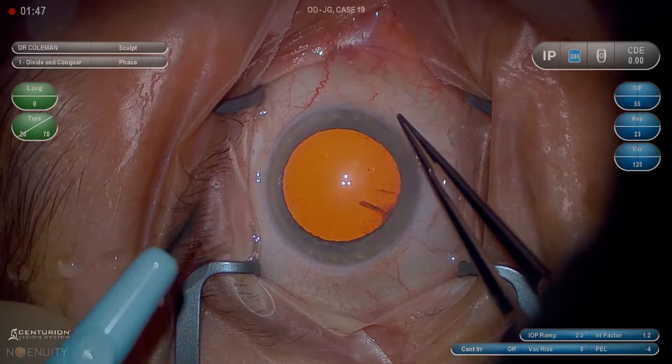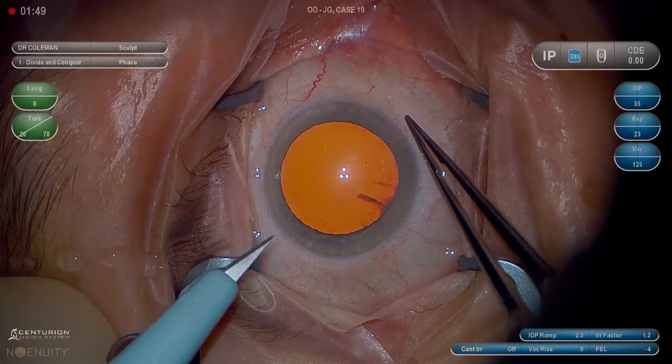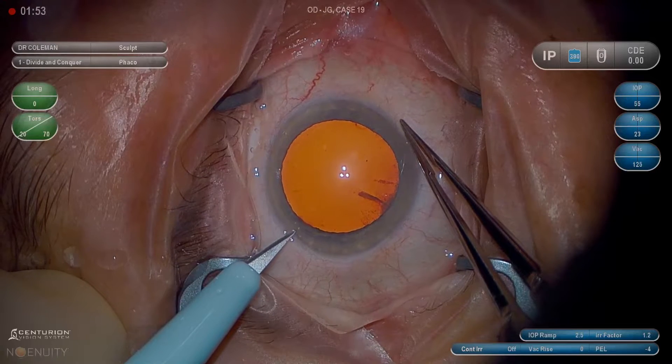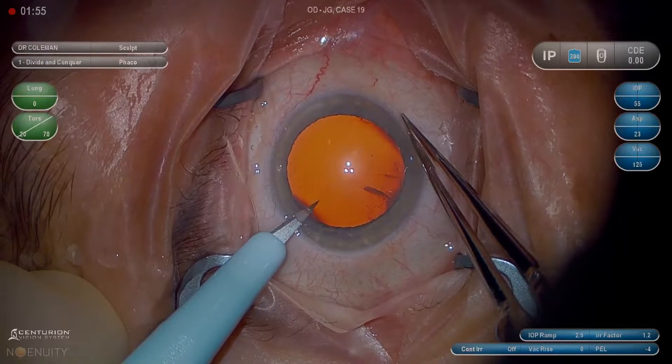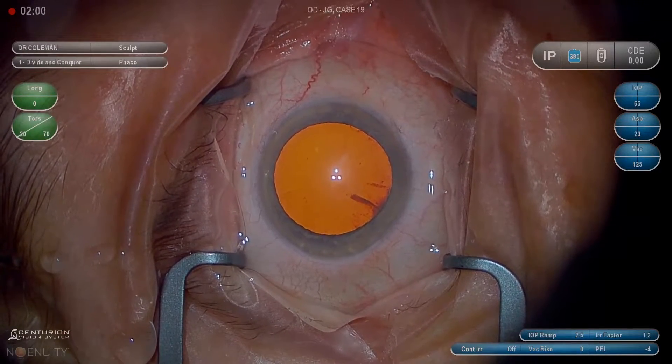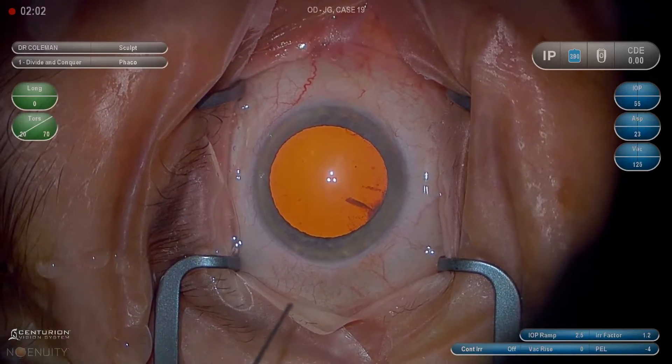We'll make our paracentesis with a 15-degree knife. I look at the base of the blade where it connects to the plastic to make sure it's not rotated, and I want to be about 0.5 to 1 millimeters anterior to the limbus in clear cornea. Try not to nick the conjunctiva — it'll cause ballooning later in the case.